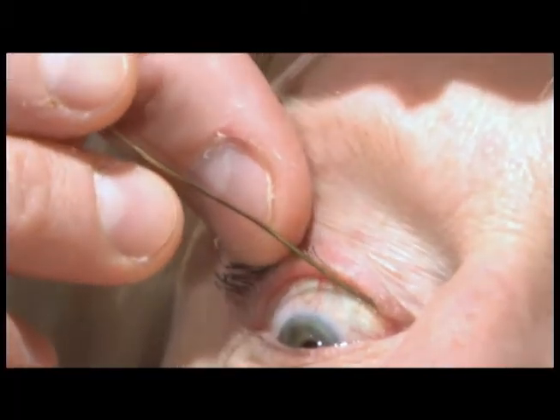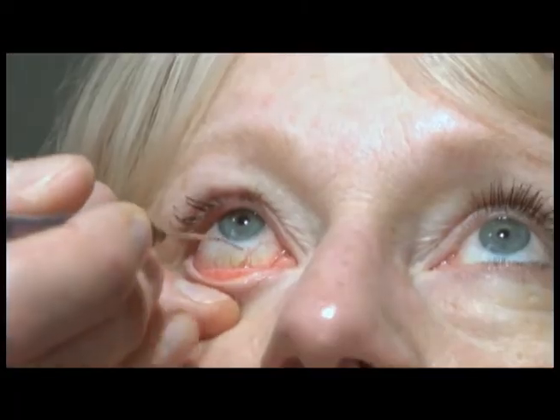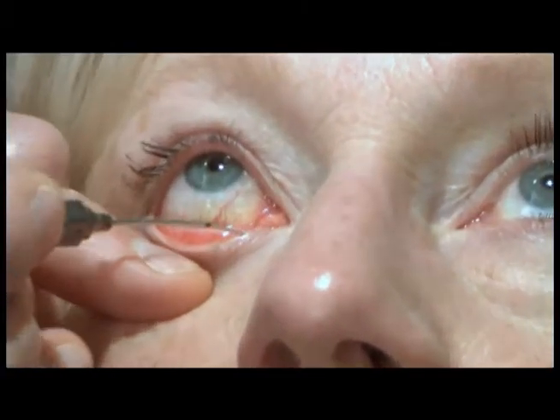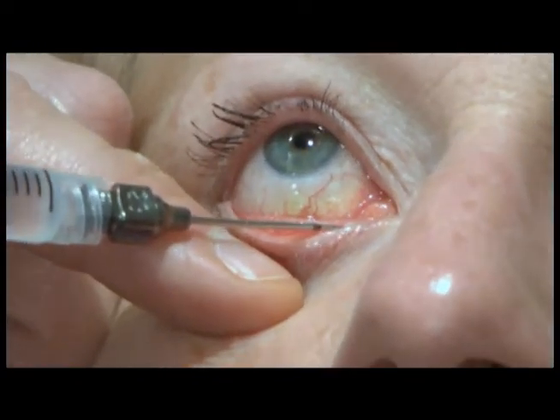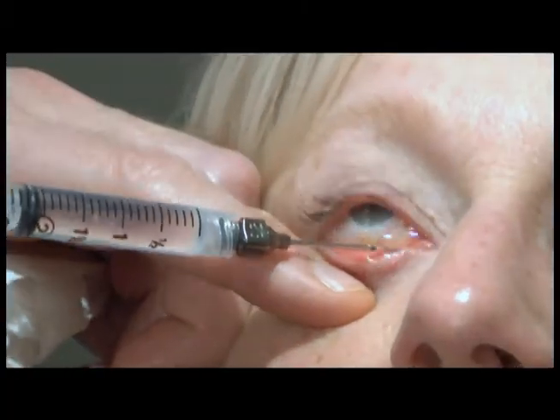A lacrimal cannula on a 3cc syringe filled with saline is then used to evaluate the patency of the nasolacrimal duct. The lacrimal cannula is introduced into the canaliculus followed by irrigation with the saline. The patient should be able to taste the saline in the back of their throat if the nasolacrimal duct is not obstructed.